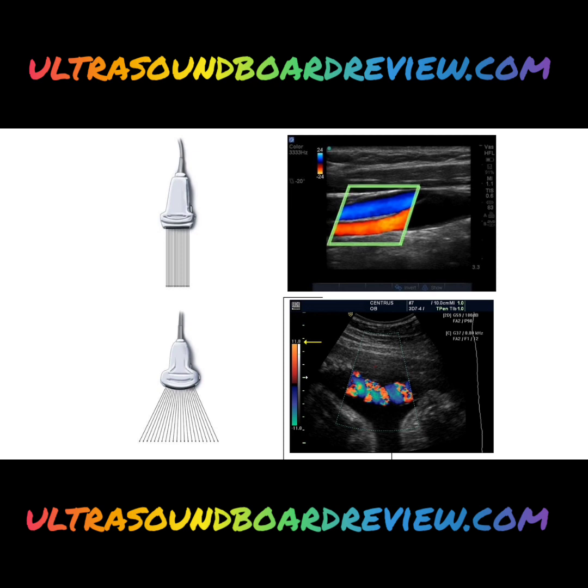Another important part of using color Doppler is the color box. It's different for linear versus curved transducers. The color boxes tell the machine where to transmit the Doppler signal. They can be increased and decreased in size and positioned anywhere on the B mode image. The color box for a linear probe can be steered in multiple directions, like it's shown here, or it can be straight up and down. And the color box for a curved probe cannot be steered and will always have this fanned appearance. Notice though that both images still have a color map.